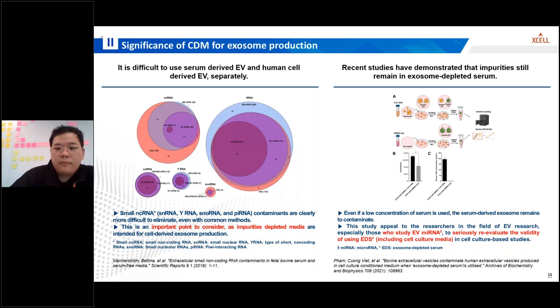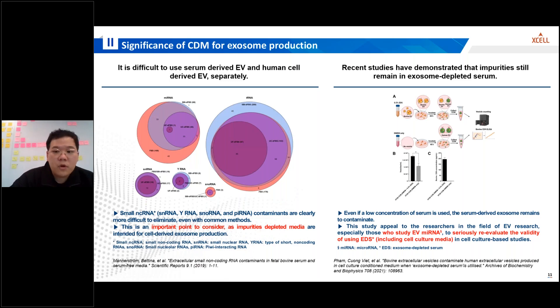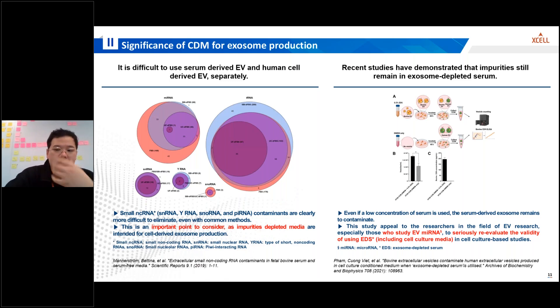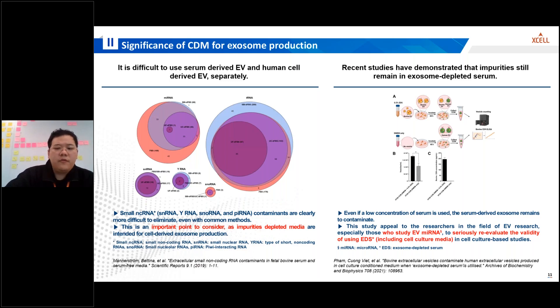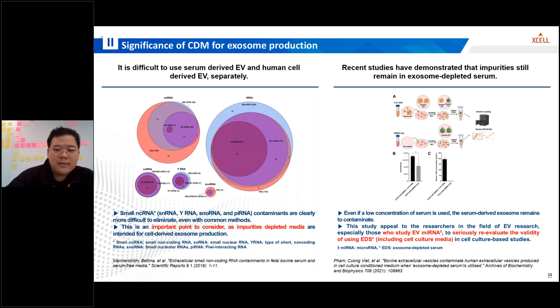Separating serum-derived EVs from human cell-derived EVs presents challenges. While common methods can efficiently eliminate certain contaminants, small non-coding RNAs such as snRNA and Y-RNA are more difficult to eliminate. So researchers in the field of EVs — particularly those studying EV microRNA — must critically evaluate the validity of utilizing exosome-depleted serum and media in cell culture-based studies.